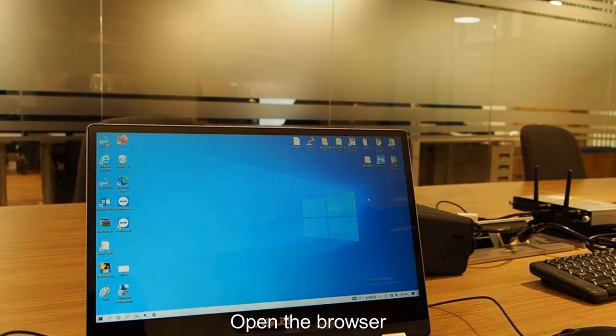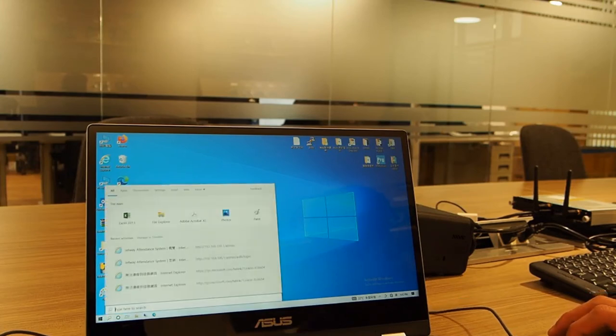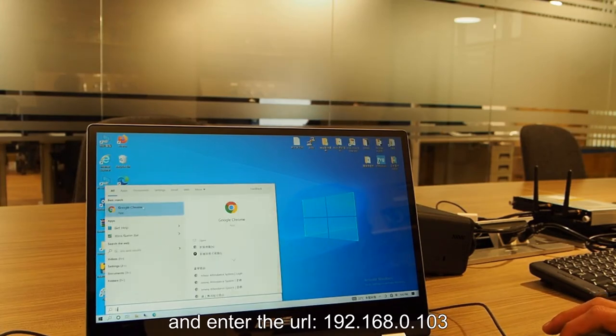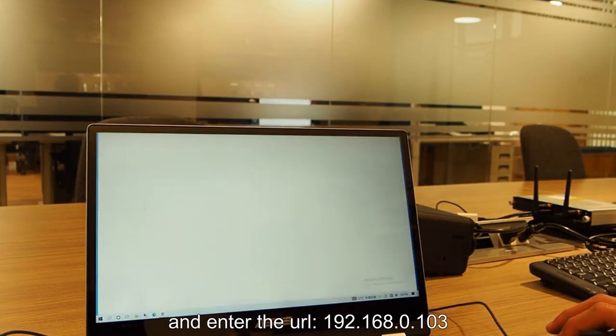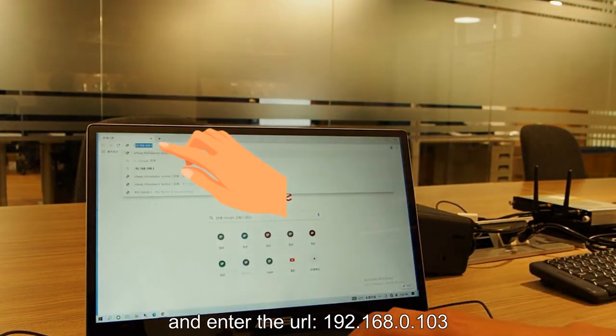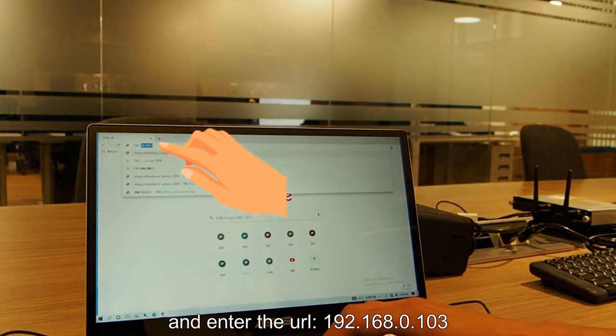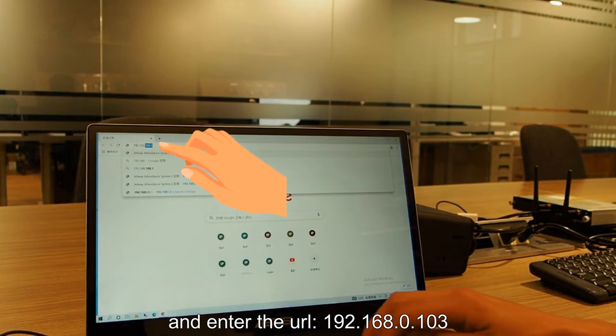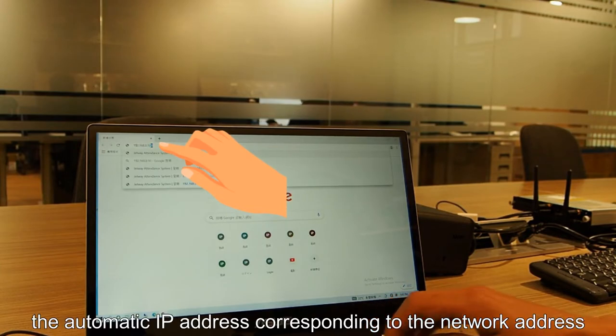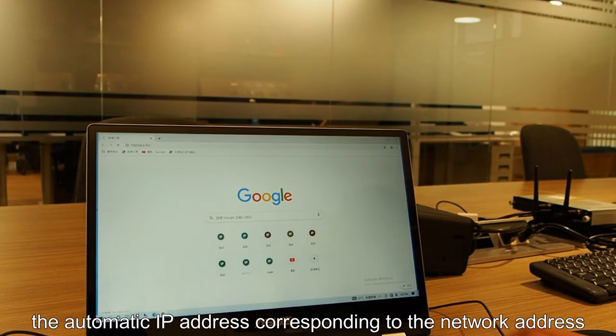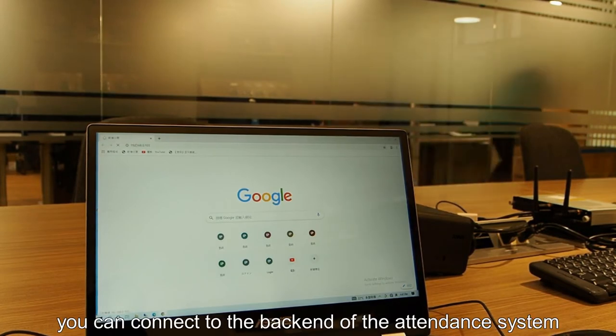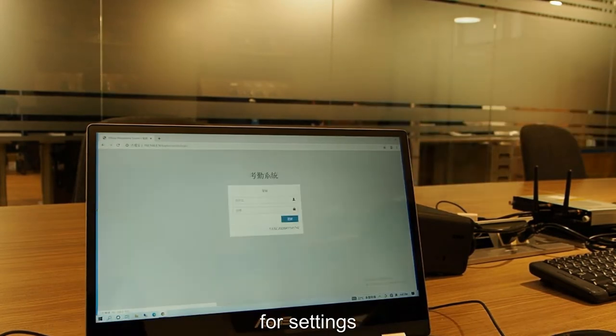Open the browser and enter the URL 192.168.0.103, the automatic IP address corresponding to the network address. You can connect to the back end of the attendance system for settings.